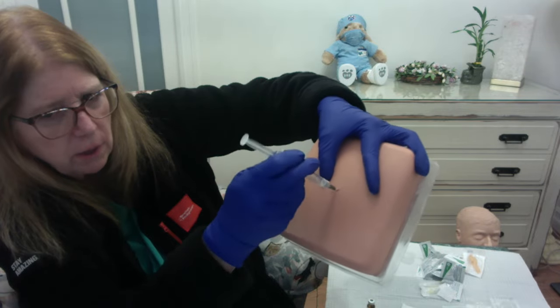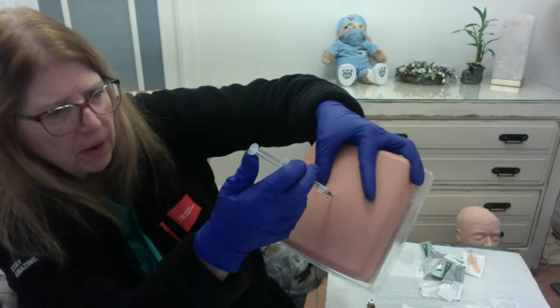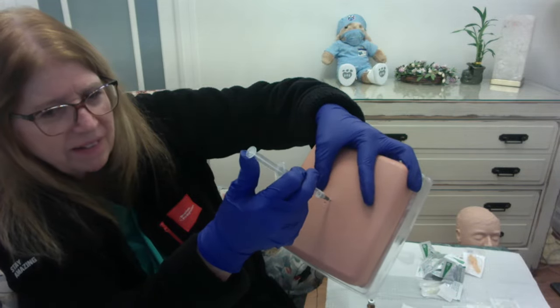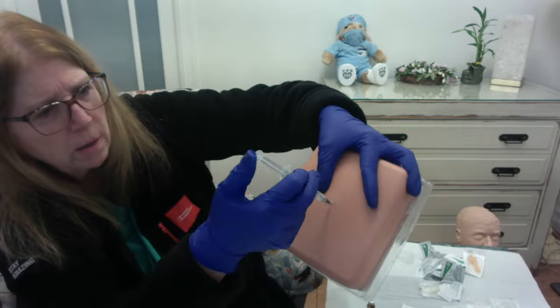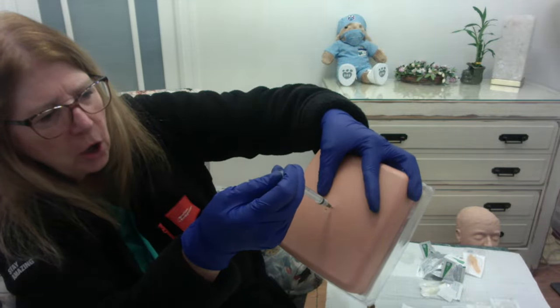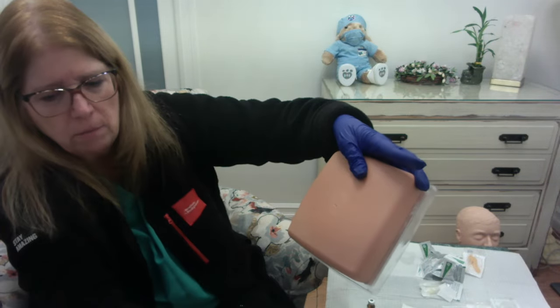None of this, okay? Very painful. Keeping that syringe steady. I'm going to use my thumb to pull back just a little bit on the plunger. If I see blood, I have to remove it and I got to start all over again, okay? Everything gets thrown out. No blood. I can go ahead then and inject this, release the fingers, and out comes the needle, okay?